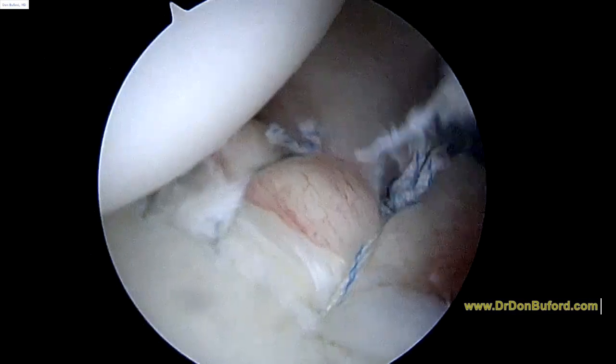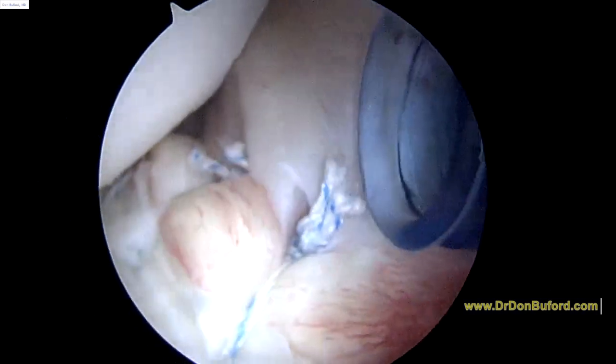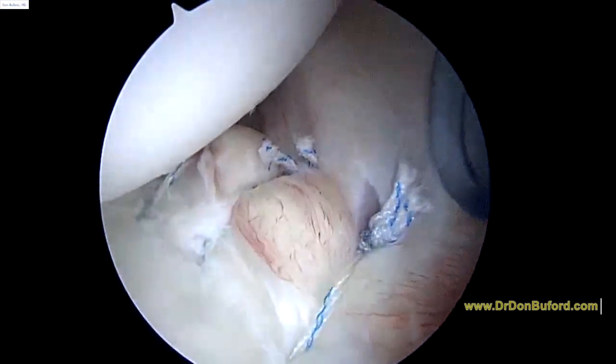So now you can see what we've done here. And if we focus a little bit better, there we go. So now you can see what we've done in the back. So I'm happy with the way that looks for our posterior reconstruction.